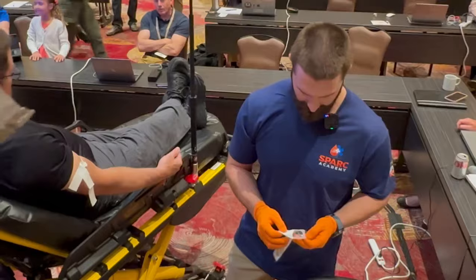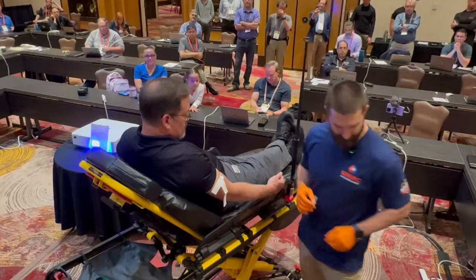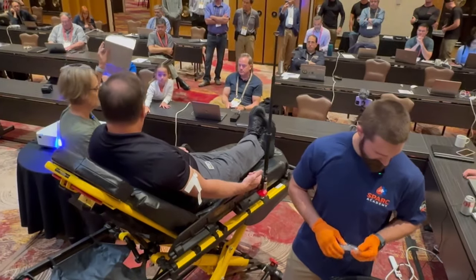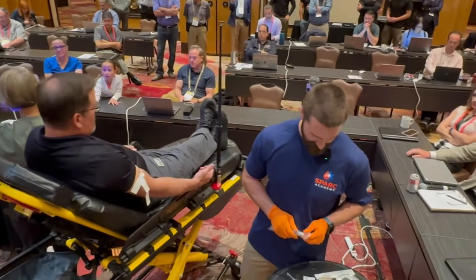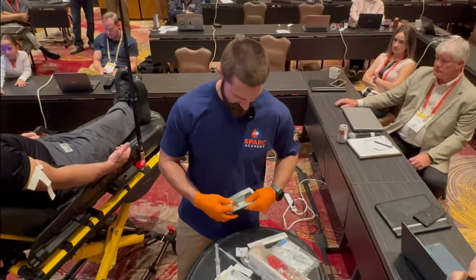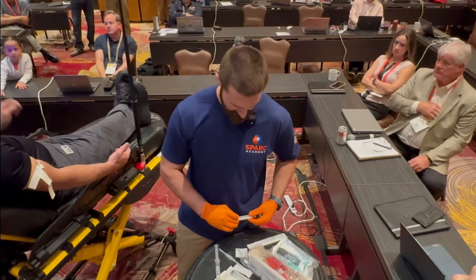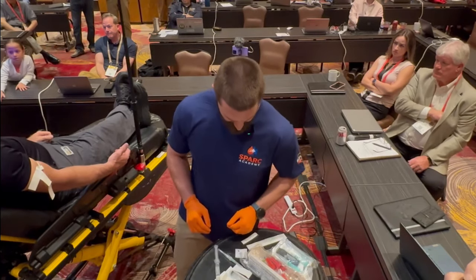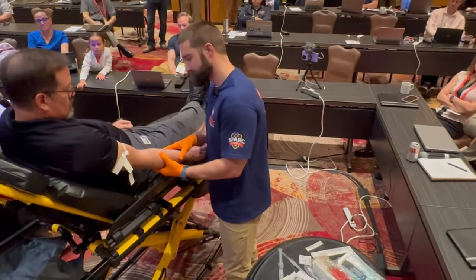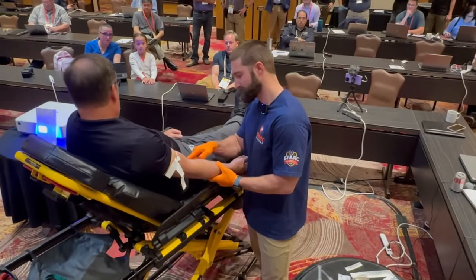It is almost the exact same blood bags that you would use from blood centers. This is a blood bag containing CPD. There are two additives that can go into blood bags: CPD and CPD-A1. Clinically it doesn't matter much, but operationally, CPD is only good for 21 days while CPD-A1 is a 35-day additive. It's nice to know you can keep the bag a little bit longer as you're planning your programs.